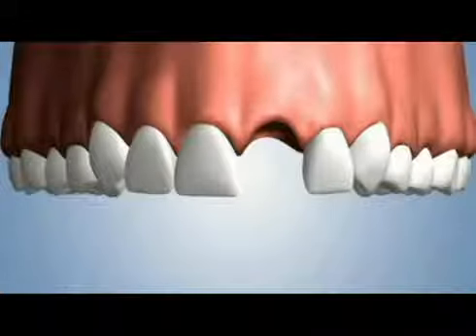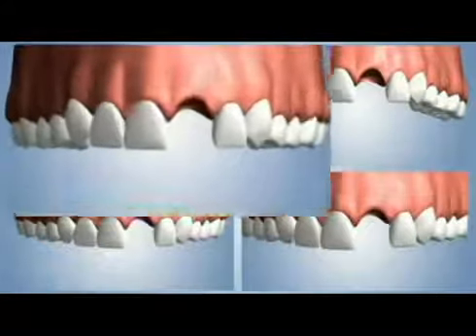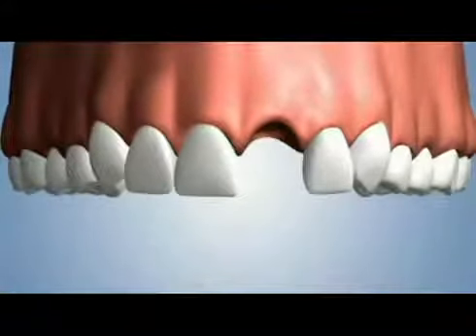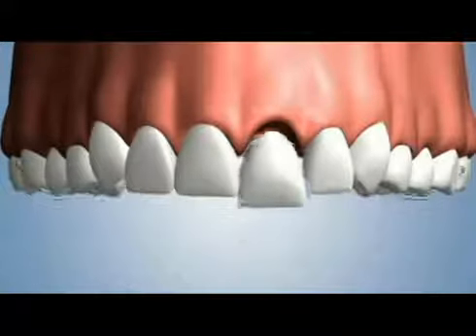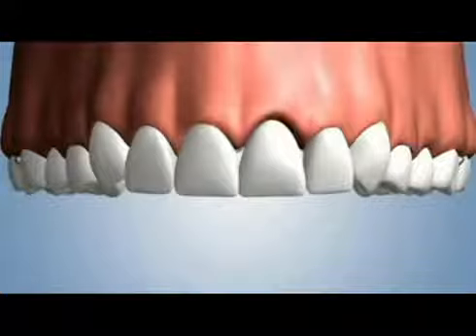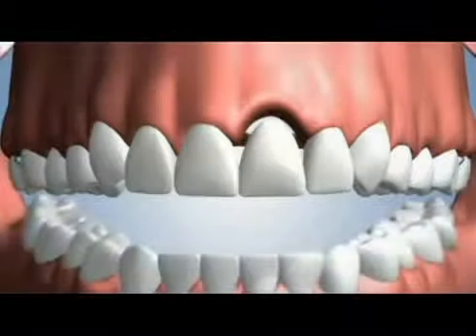If you have lost a single tooth, you have various tooth replacement options to consider. One option would be a single tooth partial denture. A major consequence of this option is the bone loss that occurs due to the absence of the natural tooth root.